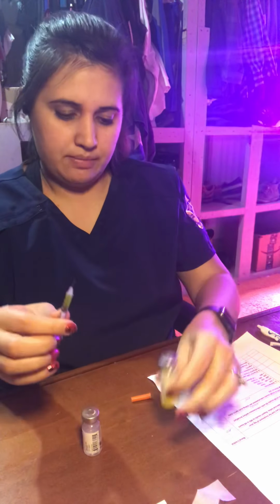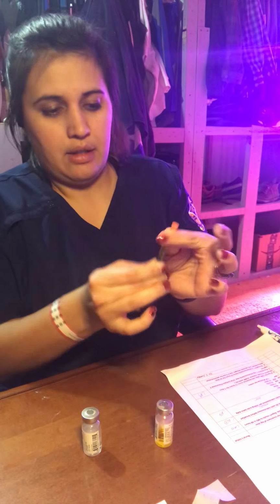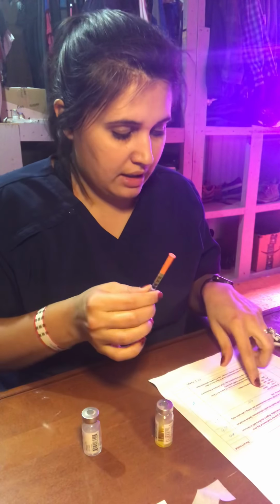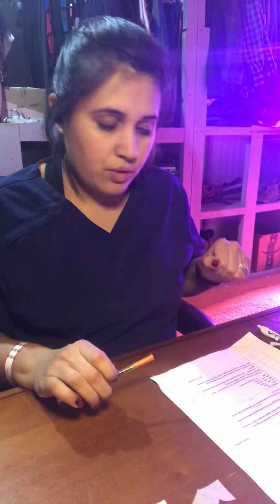I'll pull that out. Recap. Verify with another nurse that it is correct and that it correctly matches my order. Put the insulin away. I will go to the patient's room.